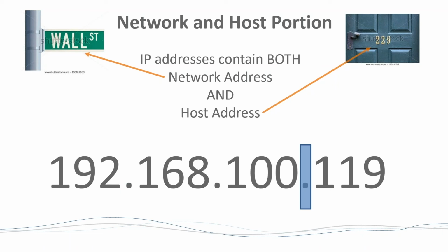How do we know it was 2? The default gateway has to be on the same LAN. But we knew it was layer 2 because the way I got it there was by putting the MAC address in. That's layer 2, right? So that's the communication there. The whole communication to the endpoint is layer 3 because it's based on IP. But that little hop to the next hop is a layer 2 hop, right? The whole thing is layer 3.